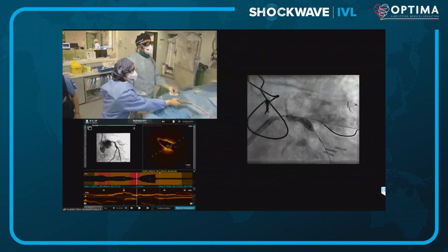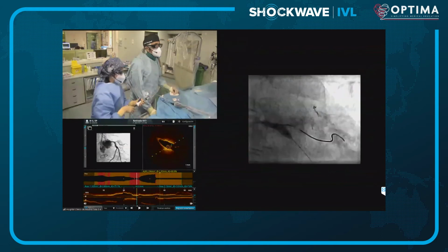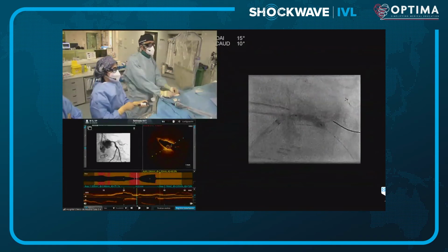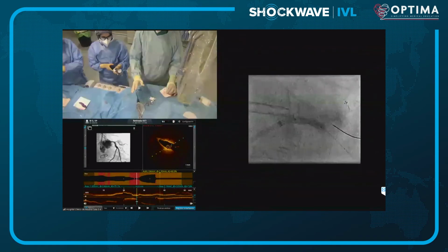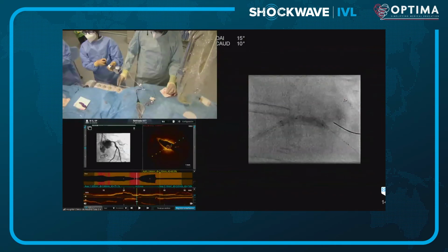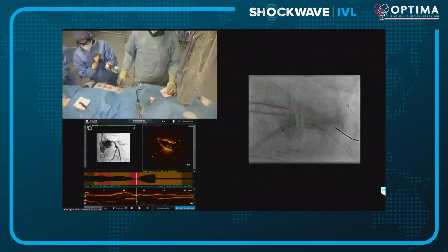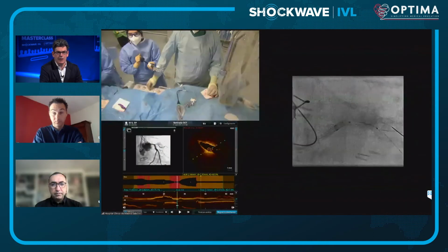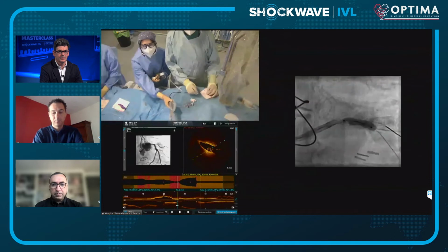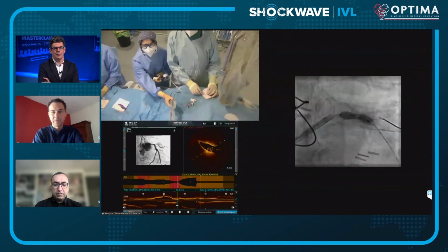So maybe come a little more proximally, because you're definitely expanded distally. Yeah, it needs to go a bit more proximal. Absolutely. So energy. It's improving. This last run was quite a bit better, I think. I would keep going in that region. It is improving. I'm just putting it back a bit, because I think it's important, as we mentioned before. Sometimes you need to do this. Much better.